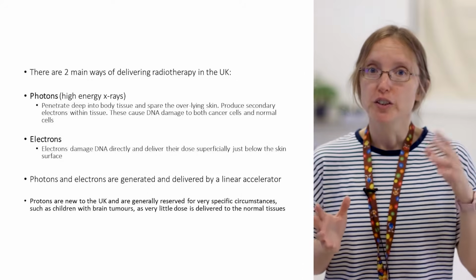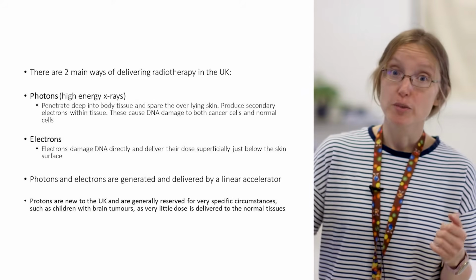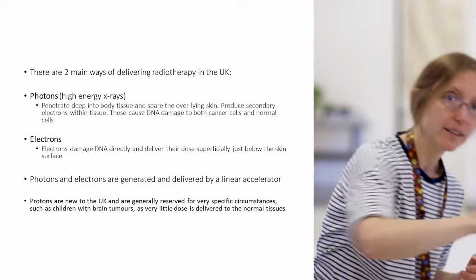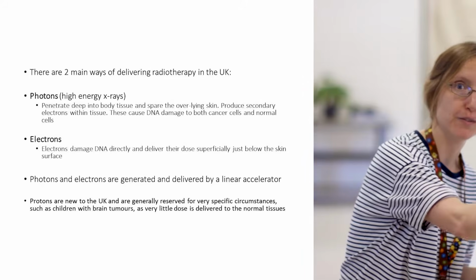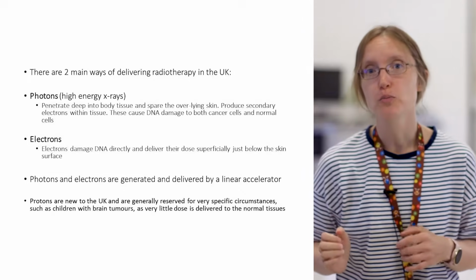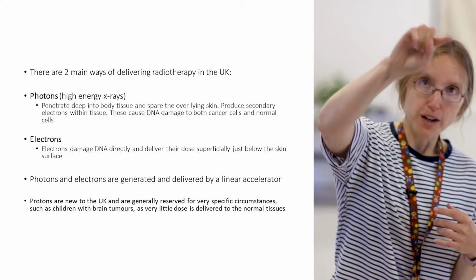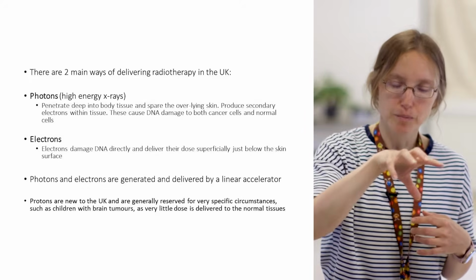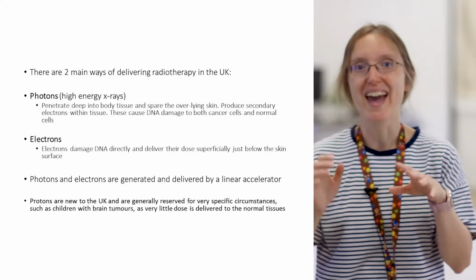If you think about a proton compared to a photon, if you think about Angry Birds on your iPhone, the red Angry Bird is like a photon. It comes along, hits the pig and keeps going. That's like a photon. We get this exit of the Angry Bird, or the exit of the photon. Protons are more like the black Angry Bird in that it travels into the tissue, you press the Angry Bird and it drops down and delivers all its dose in one place, and it doesn't travel on. That's a bit like a proton. There's no exit dose.